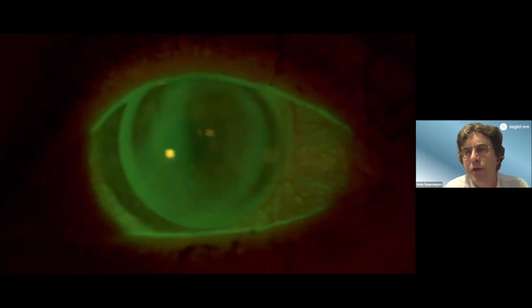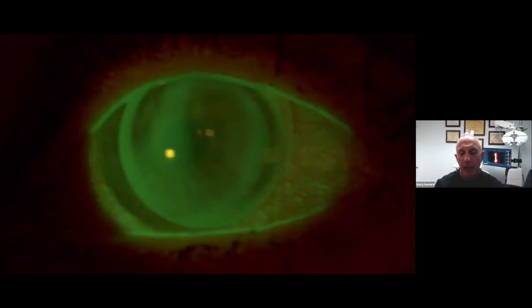what made it such a challenging eye to fit a lens on? Well, she'd again had multiple surgeries. She'd had the RK surgery from way back, and then they had tried to clean it up with a couple different PRK attempts. So you've got a very, very irregular shape and a very unusual shape. As we all know, the RK are tough enough as it is, and then you add on the PRK.